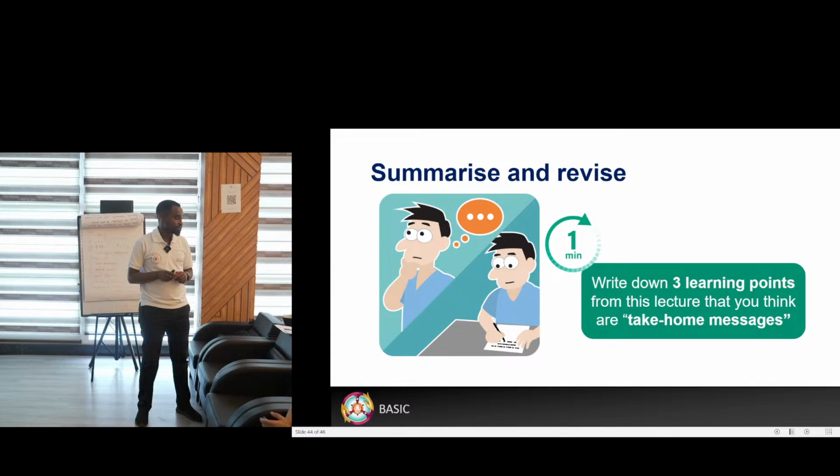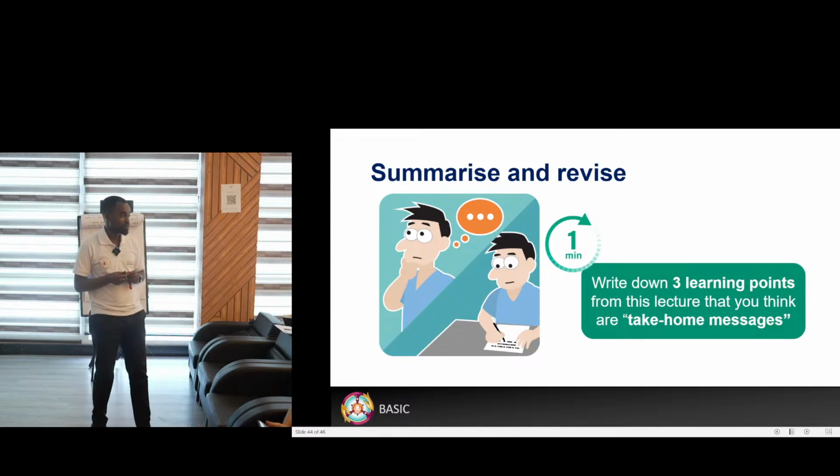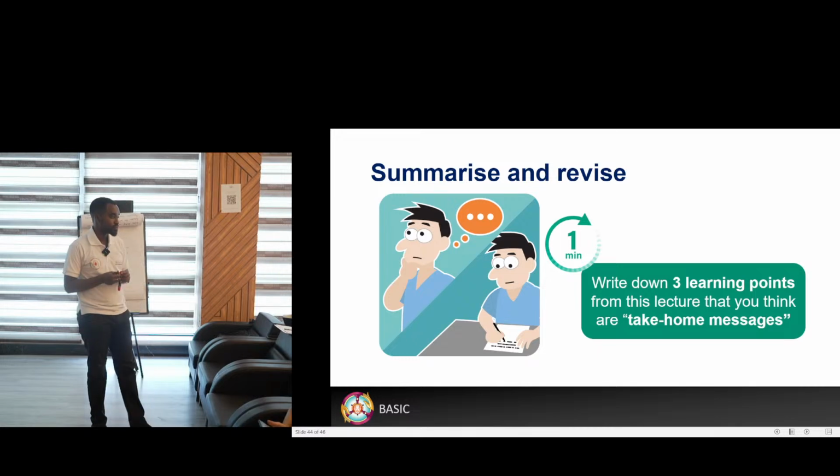So the more you look at those numbers, if I have a limited number of patients, like in the private hospital, normally I would go every hour. I'll check my vent, I'll check the graphs. There are so many things to learn. This is just basic. There are pressure loops, there's the flow volume graph, so many things that can tell you. But it's your way of how much you are motivated to learn all this.